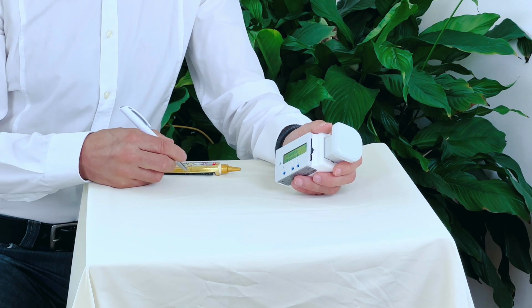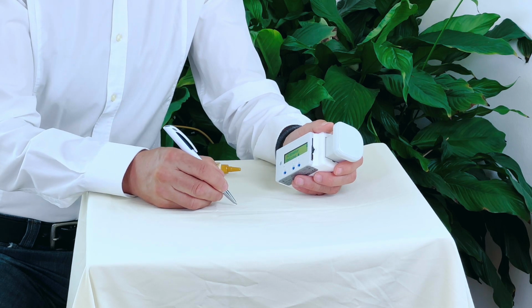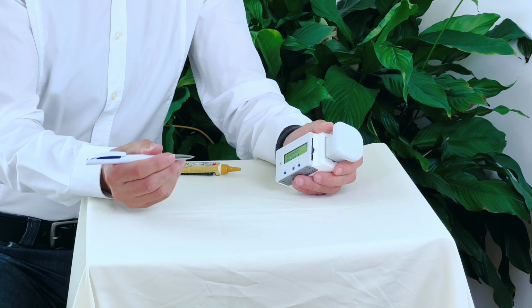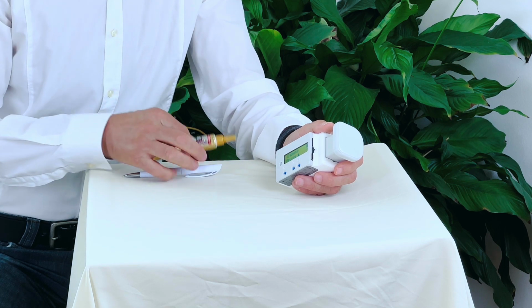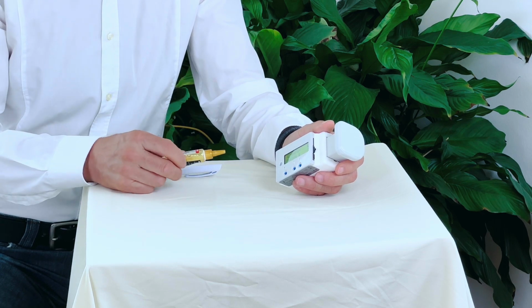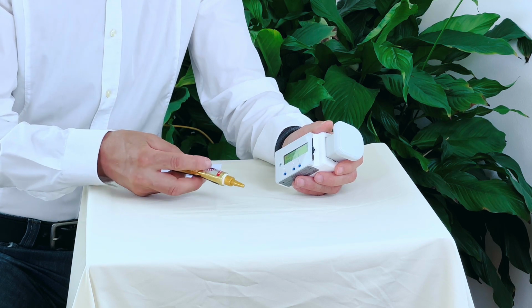When you're ready to measure, we recommend that you mark the exact measurement spot on the skin. Normally, you can mark it with a pen like this. But if you want to mark the spot on the skin in a way where you find the spot again several days afterwards, then we recommend to mark it with a henna device.